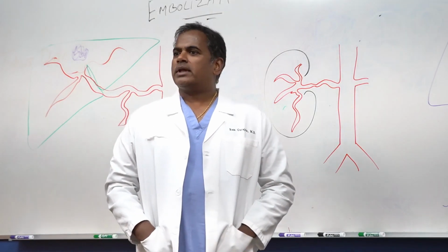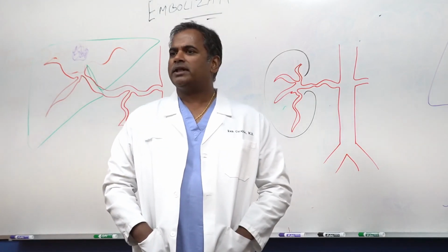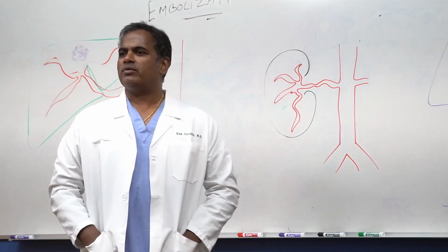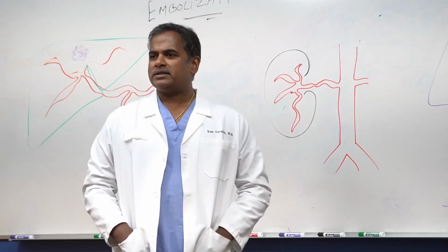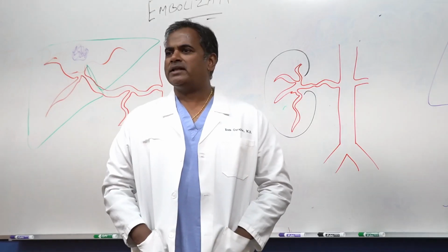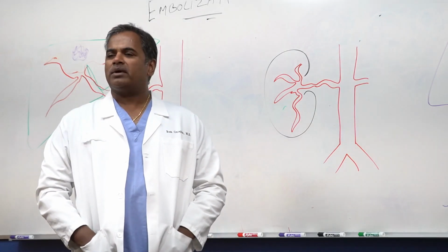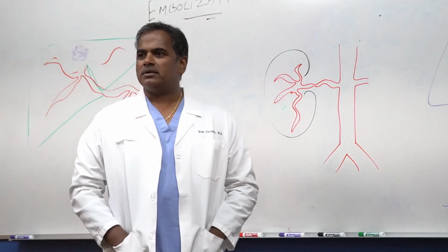Overview. This is a minimally invasive procedure in which a small thin tube is guided into the vessel which needs to be embolized. Embolization can be performed with different agents, which may vary depending on the type and location of the blood vessel.